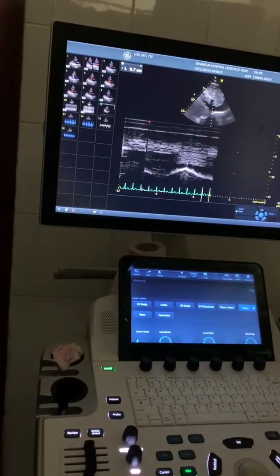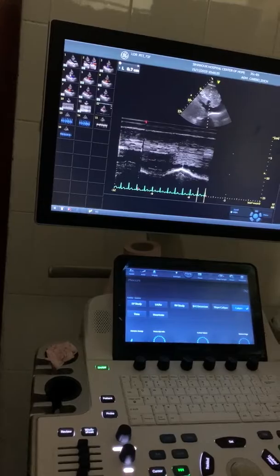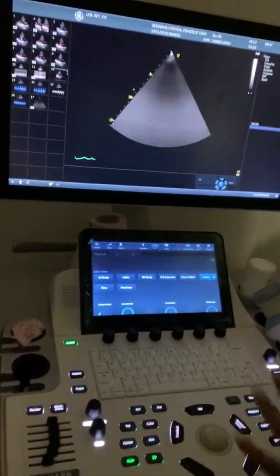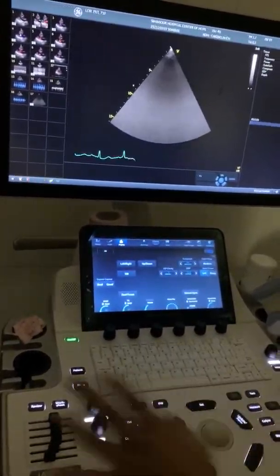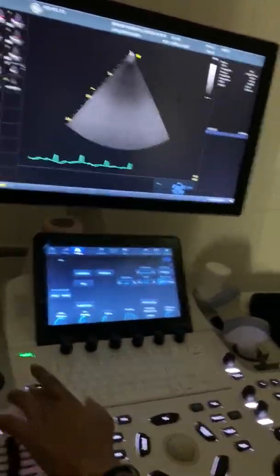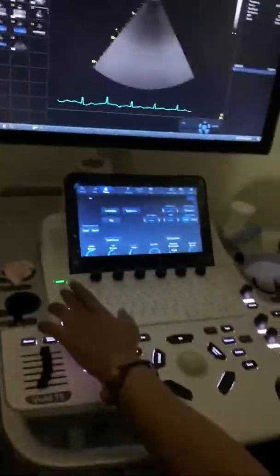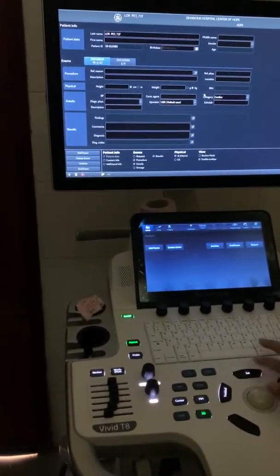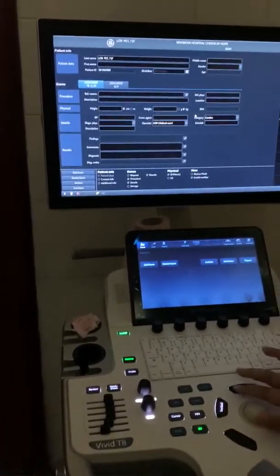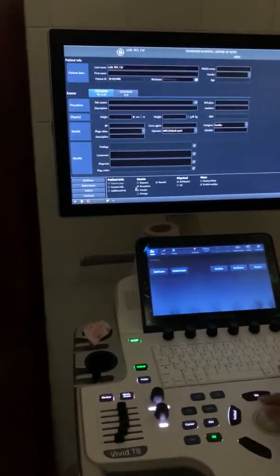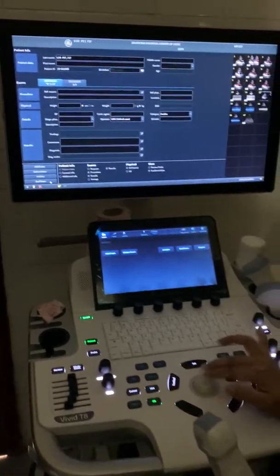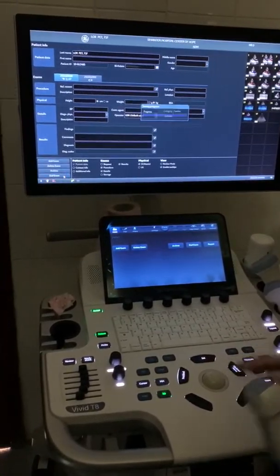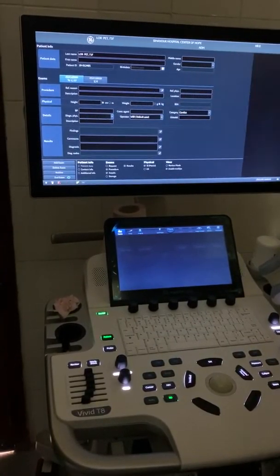Let's get another model because the patient is already done. Okay, I think we can do it. When you finish, give me the same patient and then just end the exam. At least you can practice something. Now let's go.